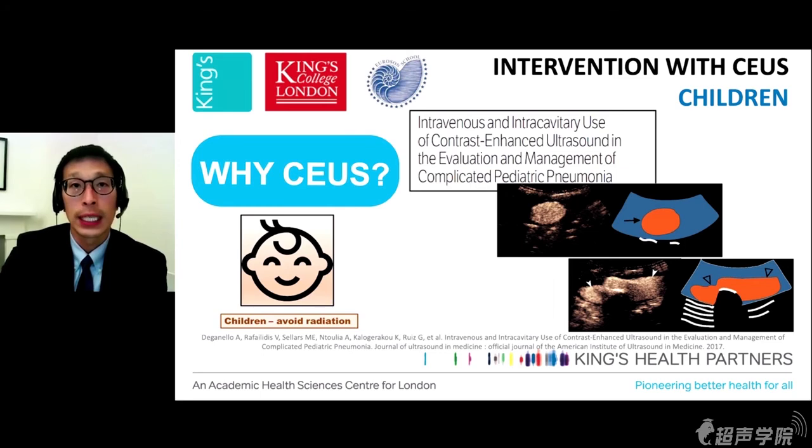If a drain is only in a locule of a collection, all the contrast agent that you inject through the drain will stay within the locule. If you see that, you can infuse some medicine to dissolve the septation, and once that's successful, you can see the contrast agent spread out diffusely once the drain is in a satisfactory position.